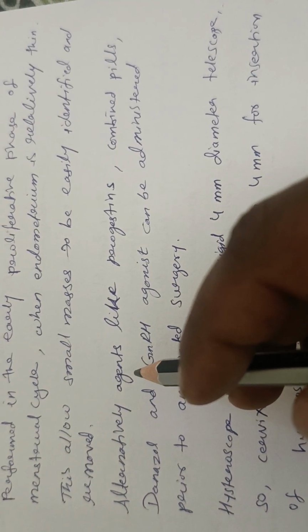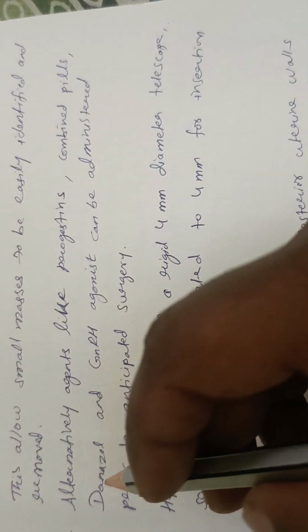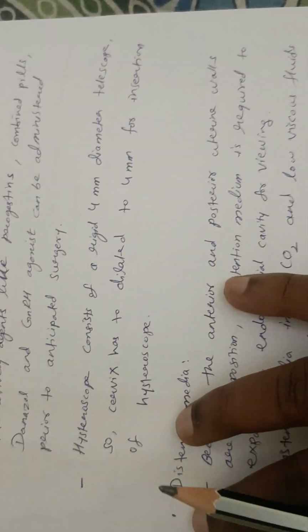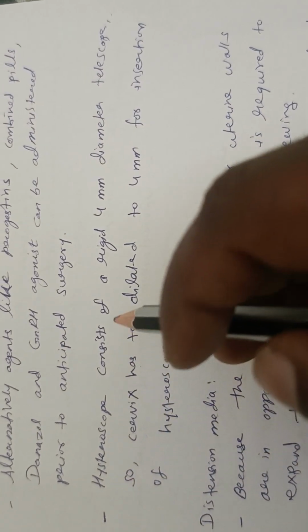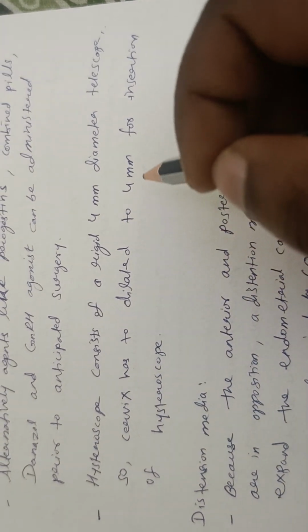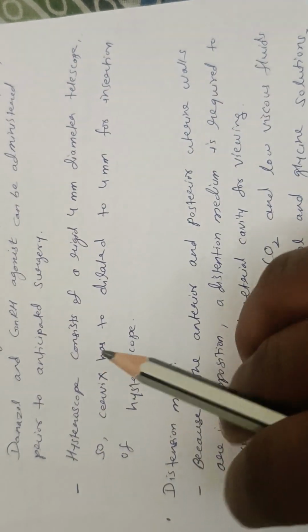Alternatively, agents like progestin combined pills, danazol, and GnRH agonist can be administered prior to anticipated surgery. Hysteroscope consists of a rigid 4 mm diameter telescope, so cervix has to be dilated to 4 mm for insertion of hysteroscope.